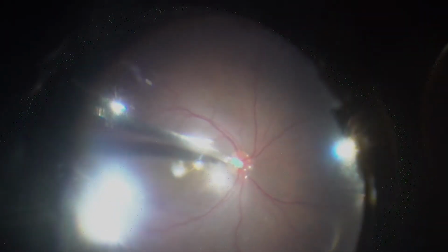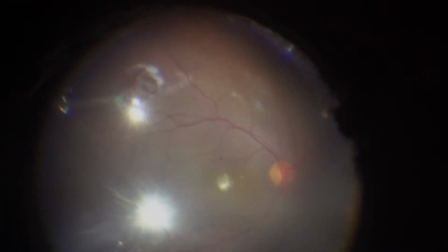We bring the retinal autograft and place it in the macular hole, and the residual subretinal fluid is gently removed with passive suction. Laser barrage is done around the harvest site and 360 degrees in the peripheral retina. In the end, fluid-gas exchange and silicone oil exchange is done for long-standing internal tamponade.